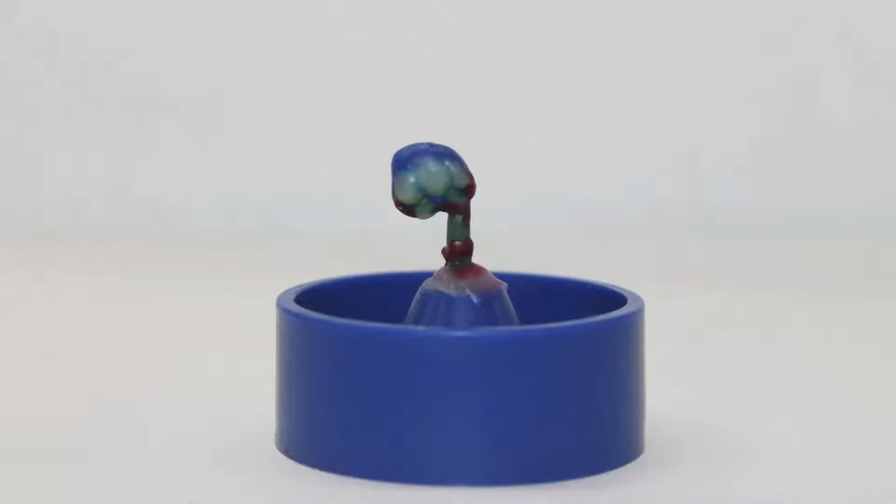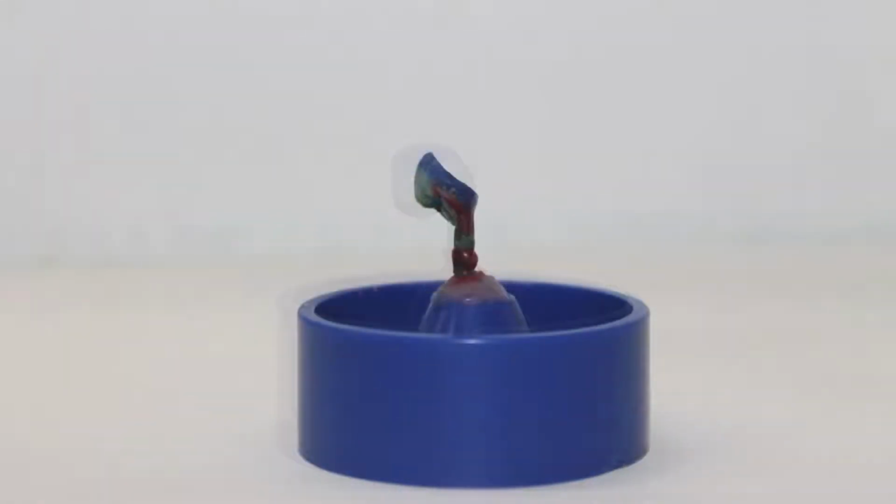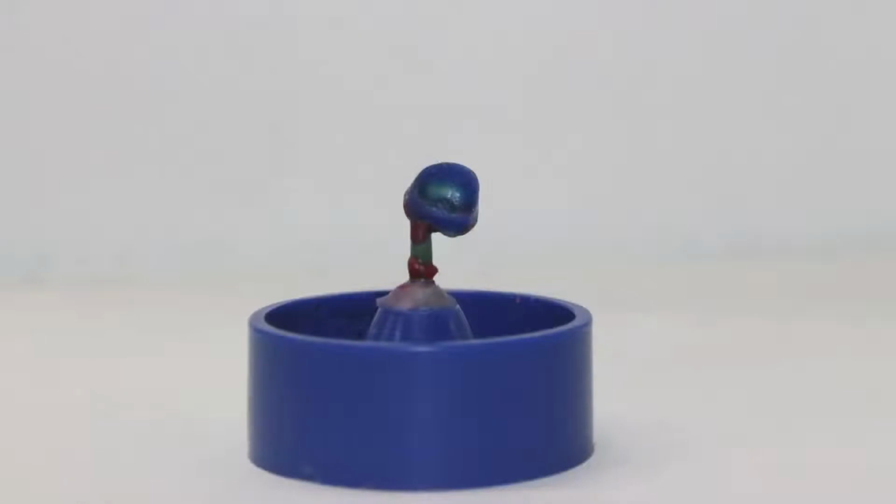The sprue former should be just long enough so that the highest point on the wax pattern will be 6 mm from the end of the ring. If the pattern is too close to the end of the ring, the molten alloy may blast through the investment during casting. If it's too far, gases may not escape rapidly enough to permit complete filling of the mold with alloy. To provide adequate bulk of alloy during solidification, the sprue itself should be no longer than 6 mm.